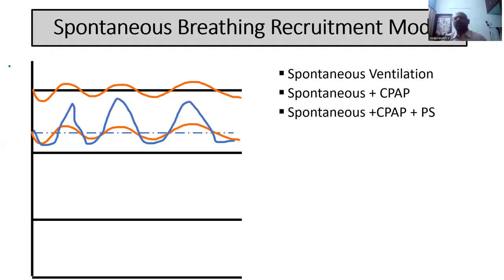When I want to breathe spontaneously, the inspiratory demand and expiratory demand valves keep themselves open. Even during any type of ventilation based on the spontaneous breathing modes, the demand inspiratory and expiratory valves keep moving, and you can take as much spontaneous breath, either fully spontaneous or pressure supported, in that ventilatory mode itself.